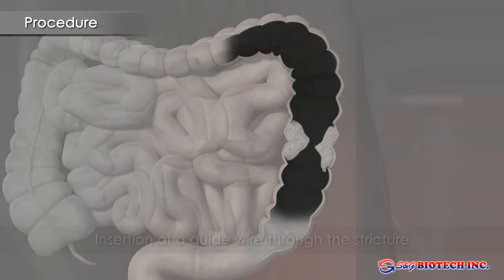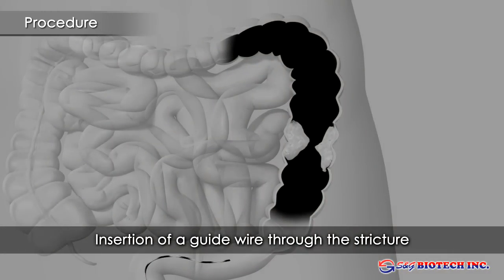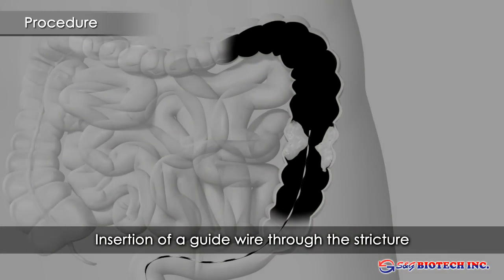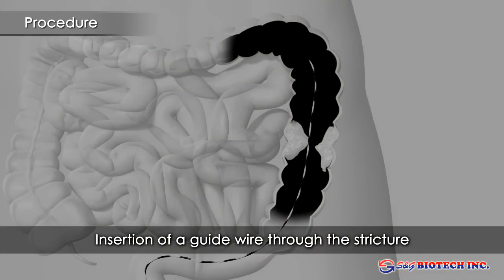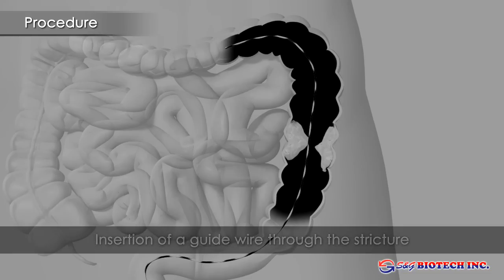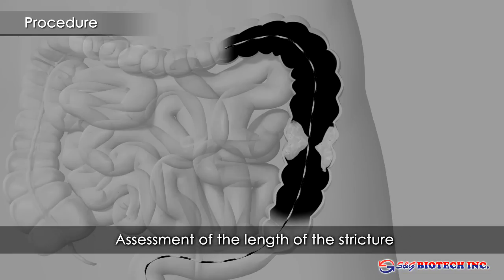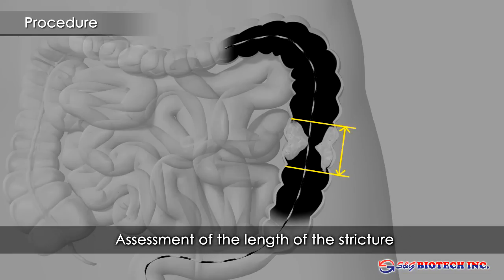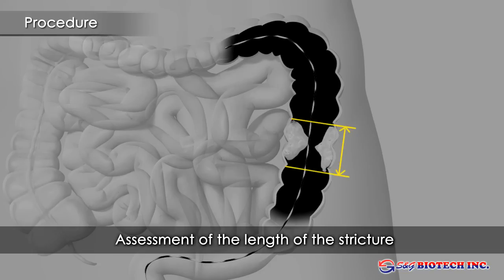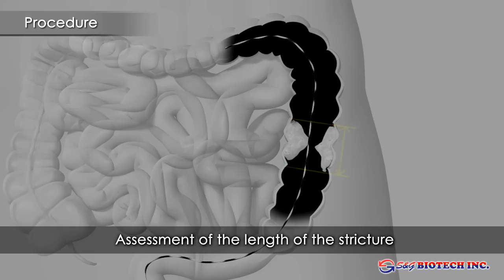With the use of a hydrophilic wire, the stricture is crossed and the upper end further delineated through injection of contrast. The stent should be chosen to exceed the stricture at both ends by at least 1-2 cm.